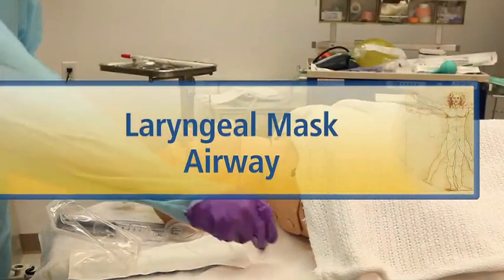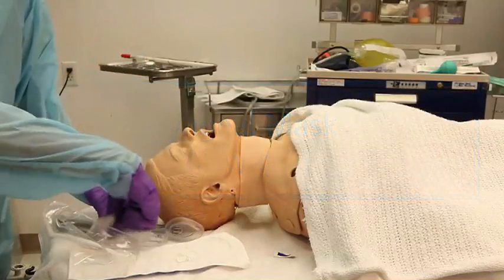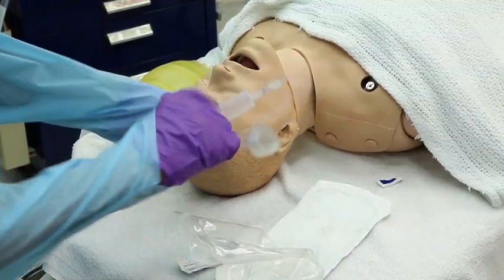Inflate the cuff of the LMA to ascertain that the balloon does not leak. Deflate and lubricate the cuff. The patient's neck must not be hyper-extended or hyper-flexed during the procedure.